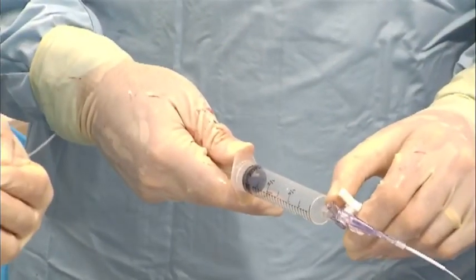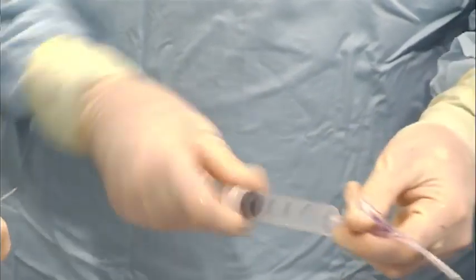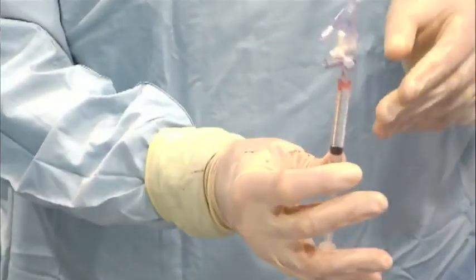This is very hard to get contrast down to the Stingray balloons. This is how they came up with this idea of getting it to actually suck contrast into the balloon. And then we're going to make sure there's no air in the stopcock.